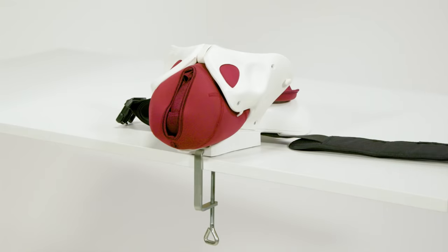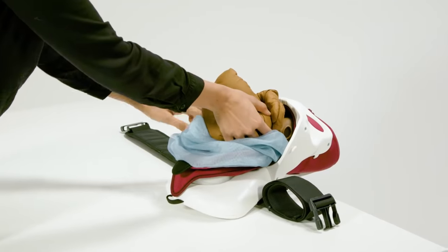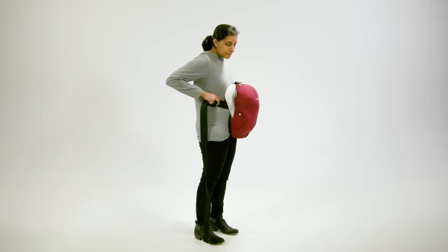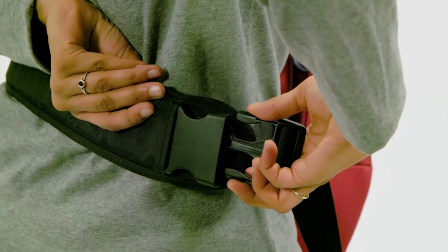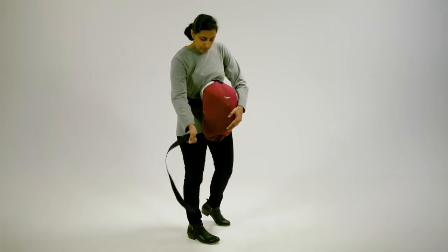Mama Berthi can be used on a tabletop to demonstrate skills, but it's most effective when worn by a facilitator for simulation. Hold Mama Berthi on your front, wrap the belt around your back, connect the clasp, and tighten the belt.